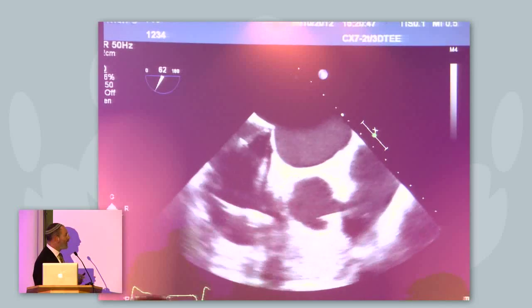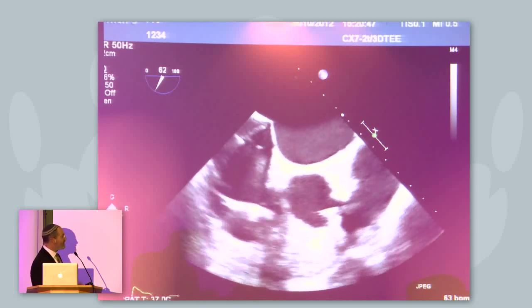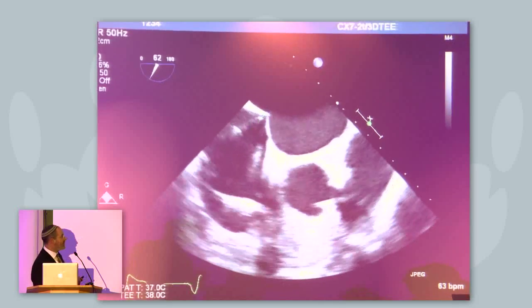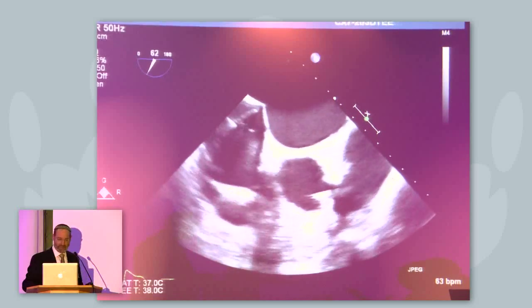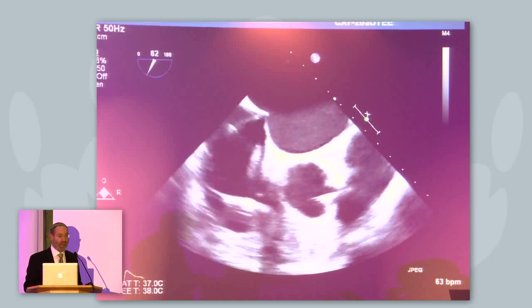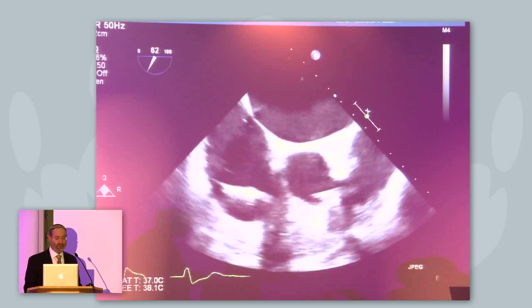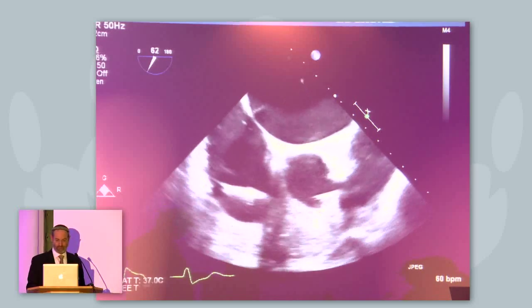When you go to puncture, here clearly this is the aorta, we've got a pigtail sitting on the aorta, we've got our pacing wire here, we've got the needle sitting on the inferior rim, on the posterior rim of the fossa, and what you can see is that our echo guy here, Dr. Adi Butanaro, who's also here, has made a major effort to try and show us the summit, so we can always see the summit so we know exactly when we're going through and at which angle we're going through at any time. We can watch it go through, we can keep an eye on the end of the needle so we know we've not traversed too far and that we can happily exchange out. It makes for a very simple and safe procedure.